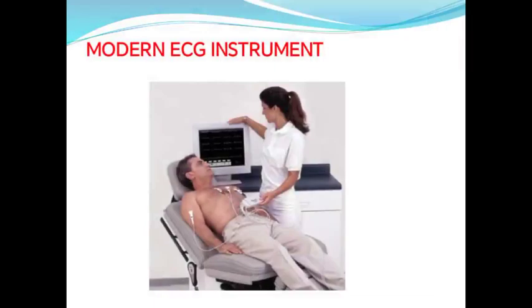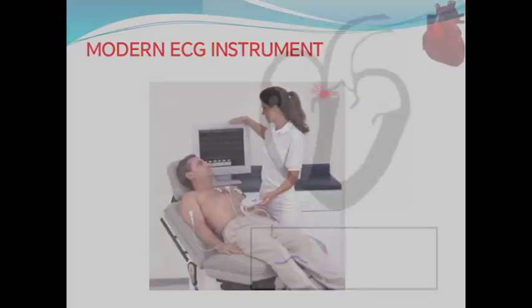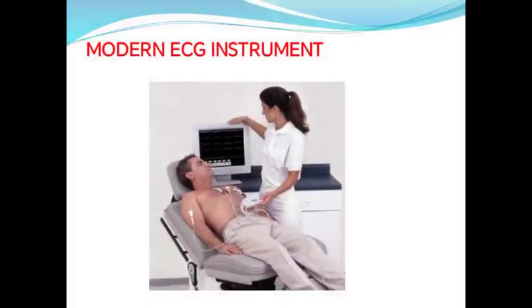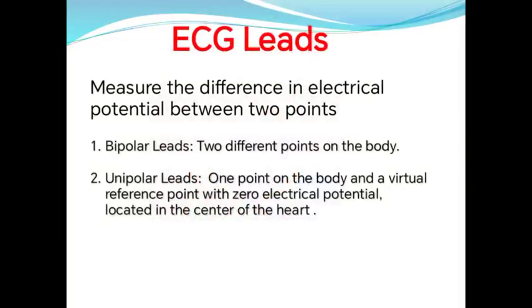Okay, we talk about the modern ECG instrument. Here it is. It is very simple. You can read the ECG before printing it out. We have the leads that are attached to the patient's chest wall. Here in this patient, this is the chest wall and this is the ECG, and we have the limb or extremity lead, this one here. This is the modern ECG lead.